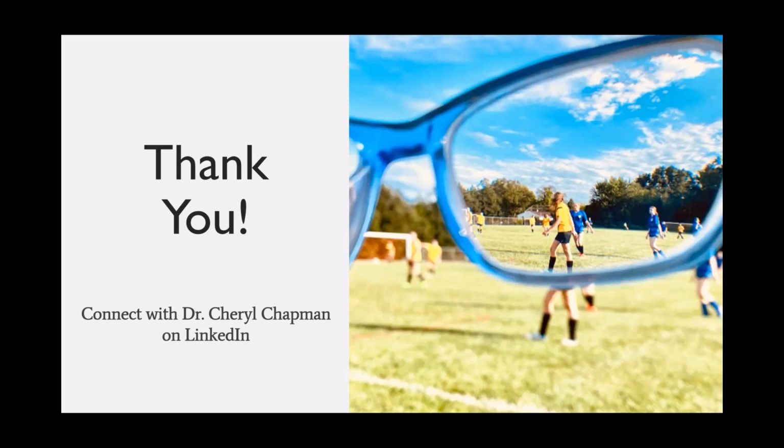Yes, I believe so. That's a really wonderful question. When I was creating this lecture tonight, I was trying to keep things more basic so as to not overwhelm the audience, because I wasn't really sure what level of experience the attendees have. But I have done that myself, where I will do a change only in that nasal quadrant for nasal decentration. And I have found it to work quite nicely. So I would say that I actually do that personally more often than I change the whole horizontal meridian.